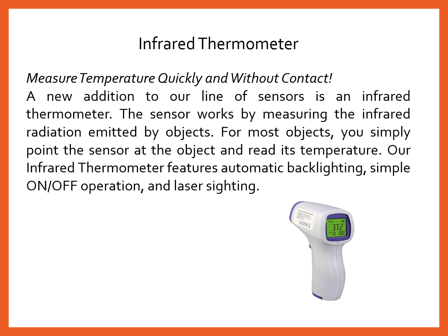So you just need to check the instruction manual on how to use the infrared thermometer, as there are a lot of infrared thermometers available in the market, especially now with the COVID pandemic.